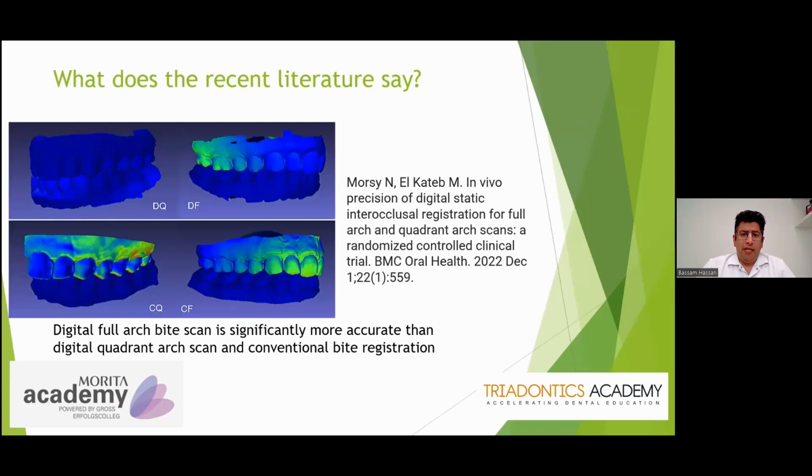But what does the literature say about bite registration? Now, if you look at the recent literature, you see the in vivo precision of digital bite registration for full arches. They did this with a recent RCT, a randomized controlled clinical trial. The digital full arch bite registration is significantly more accurate than digital quadrant arch scan and conventional bite. And that is really significant.